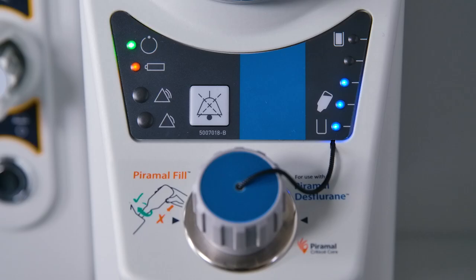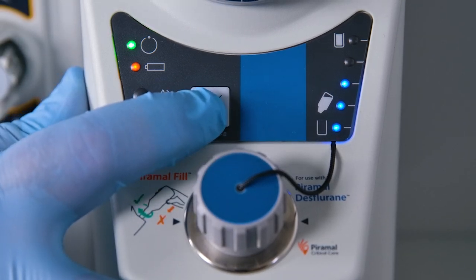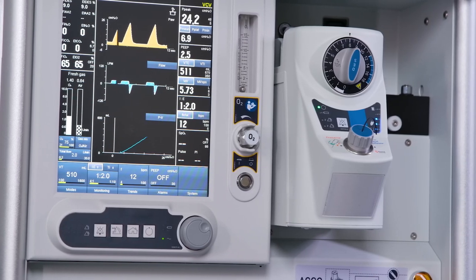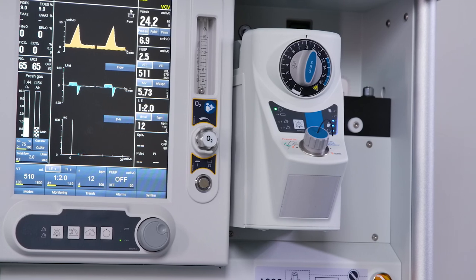Initiating a vaporizer self-test: with the vaporizer in standby mode, press and hold the mute control for 5 seconds to initiate a brief self-test sequence. All indicators will flash and the audio sounder operates during the test sequence. The vaporizer will return to standby mode when the self-test is complete. Do not use the vaporizer if there is any malfunction — the vaporizer must be checked by a trained engineer.